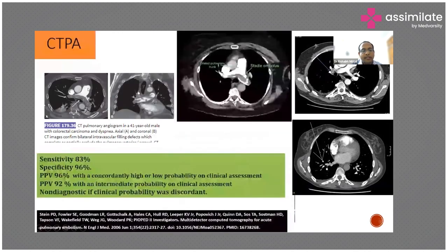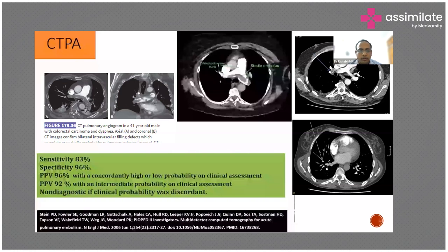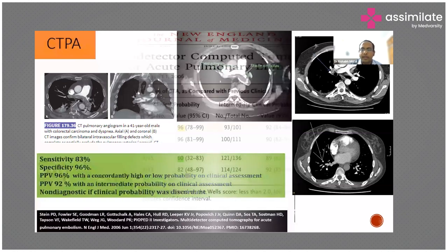This is CT pulmonary angiogram. The first picture shows a saddle thrombus in the main pulmonary trunk. Another picture shows a saddle thrombus with a segmental thrombus in the right pulmonary artery. This is a sub-segmental thrombus — incidental sub-segmental thrombus doesn't warrant anticoagulation most of the time, unless the patient is having cancer or high risk, where we may consider it on a case-to-case basis.